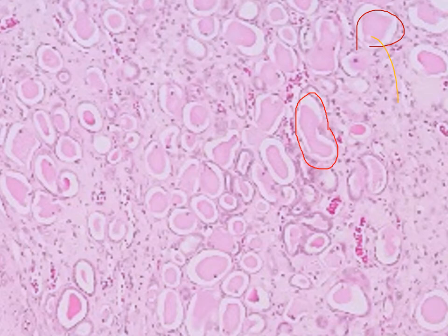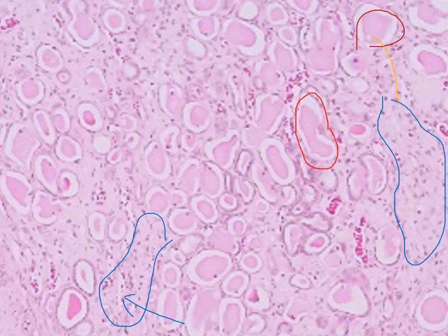This is commonly seen in chronic pyelonephritis. Apart from that, in this area it is a bit lesser, but you can have a look afterwards, as you can find these glass slides in our collection. You can assess the areas that are not the tubules. You can see there will be some inflammation within this area, and also in the stroma or the supporting tissue.